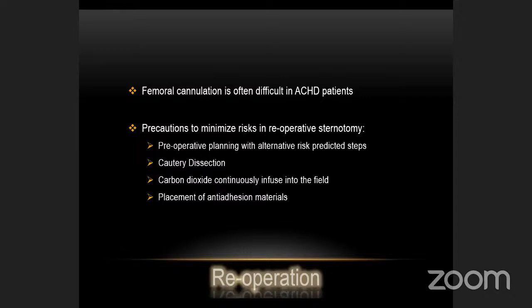Femoral cannulation is often difficult in patients with adult congenital heart disease, as they usually undergo multiple interventional catheterizations through their growth years, resulting in stenotic or occluded femoral vessels.